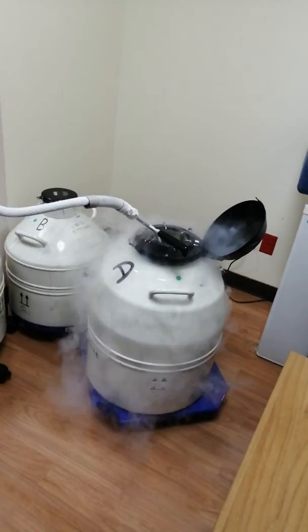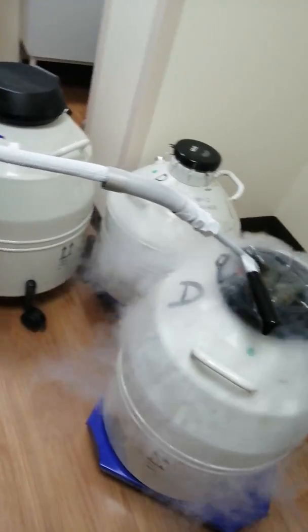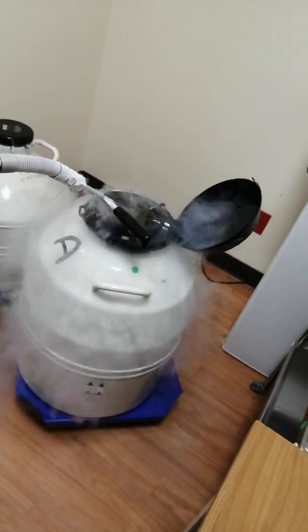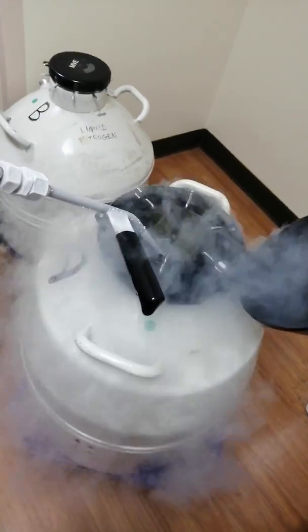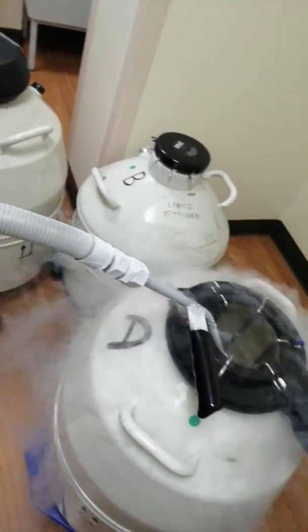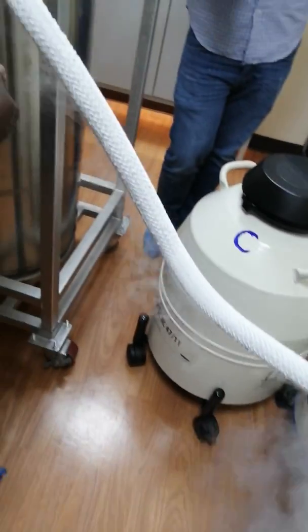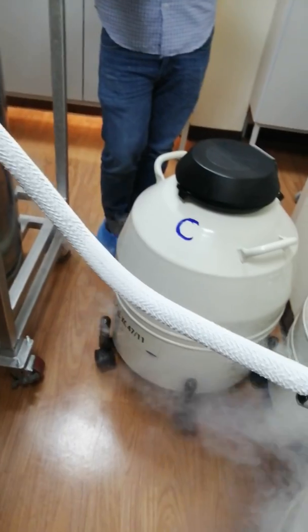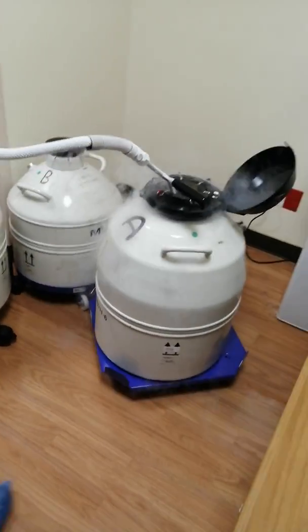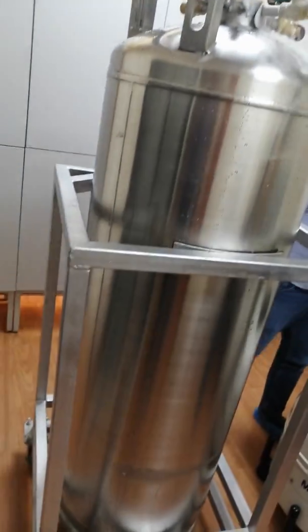We can also freeze embryos. Anything you can freeze, but each one has a special technique. If you are freezing an embryo, the embryo has a special technique depending on the stage — two-cell, four-cell, or blastocyst. Each one requires a special technique to take the water from inside and replace it with the freezing solution.